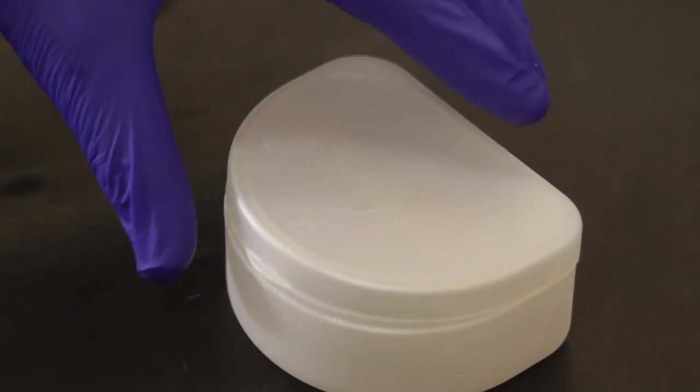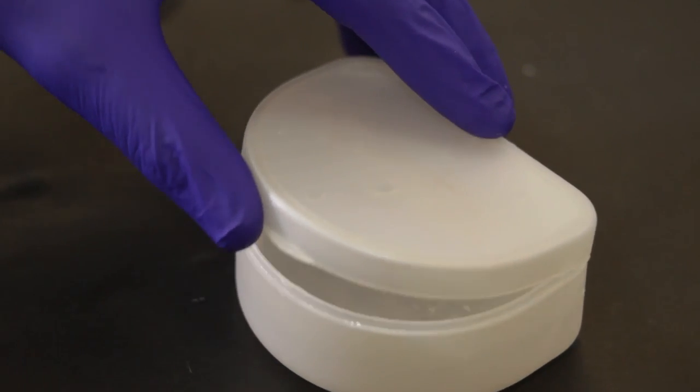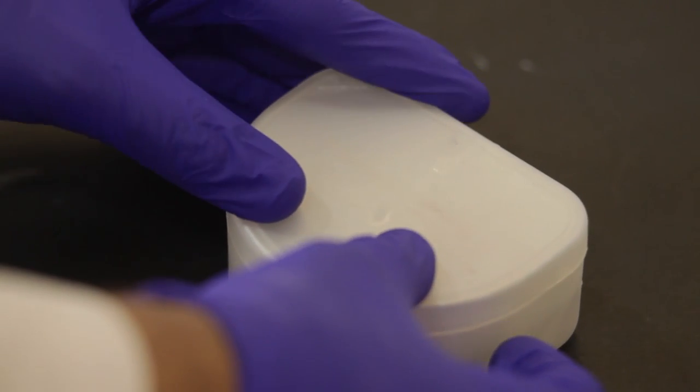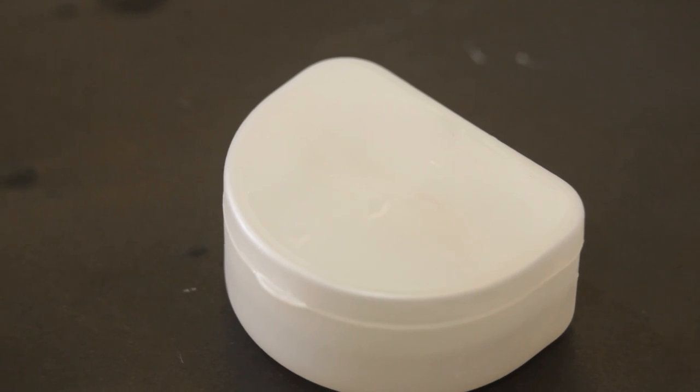The next important thing is to transport this alu wax bite in the right way. I suggest that these bites be transported in a box filled with chilled water. This will help the bite to remain viable until the time it reaches the lab.